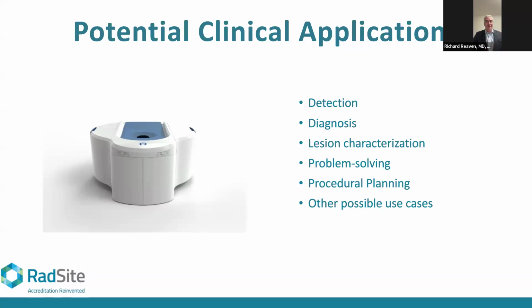But again, these are women who are still getting breast cancers, and we can't just ignore that fact. We have to find ways to adapt. We have to find tools that can be available to image these women to detect their breast cancers. And with cone beam breast CT, there are huge advantages in women with breast implants. Number one, there's no compression whatsoever, so there's no risk of any implant rupture or cosmetic malfunction or abnormality.